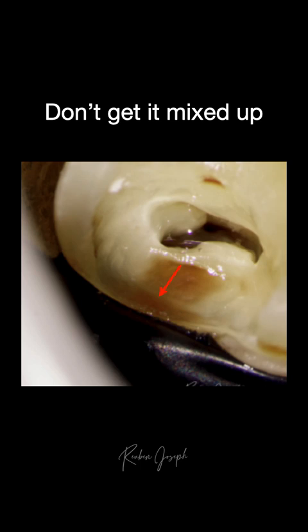Take a good look at this picture. What you can see here is a good access cavity preparation. The isolation is complete, but there is a little bit of caries left behind on the gingival seat. Say, for example, if I tried removing that caries completely at this point, the rubber dam is going to warp right into the access cavity, and blood and saliva from the gingiva is going to get in as well and compromise my isolation.